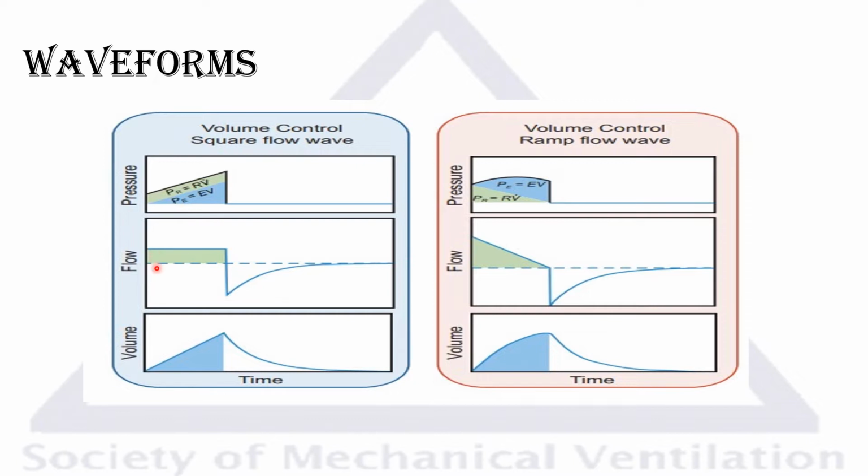Now there's a lot of research about how the peak inspiratory flow could be injurious to the lung. Versus here, you can notice that it uses a little bit higher flow. This might be more comfortable to the patient versus this. So of course you have to try and see which one you're more familiar with and you want to use.